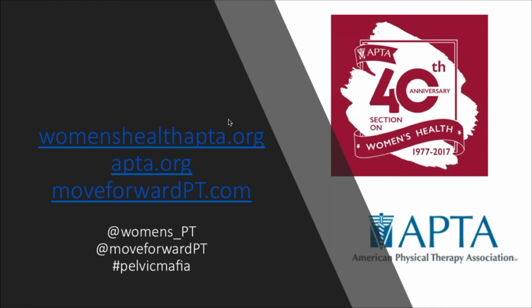Is there a clinical role for transperineal ultrasound, or does transabdominal offer sufficient information for under or overactivity? Transabdominal is a great objective measurement for fast twitch and slow twitch pelvic floor activity. Hey, Gerard, how are you?